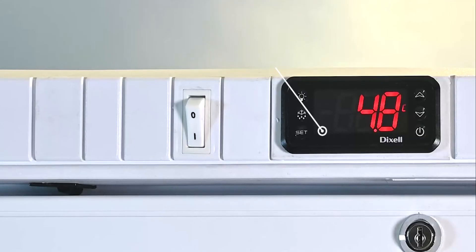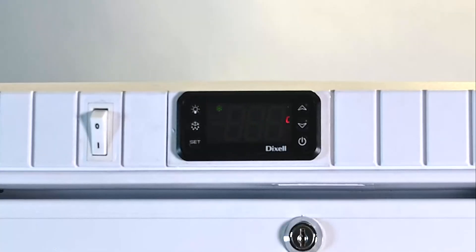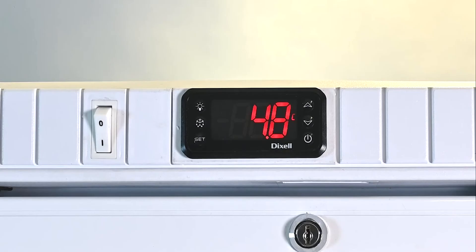To reset the maximum and minimum recorded temperatures on the Med0220GD and Med0374GD: while either maximum or minimum temperatures are being displayed, press and hold the set button for 3 seconds. The screen will display RST. The RST will start blinking and then return to the normal display, signifying it has been reset.